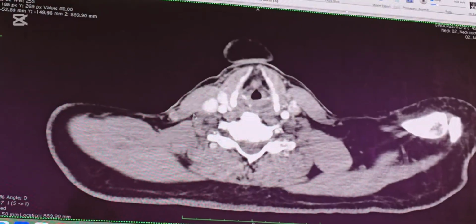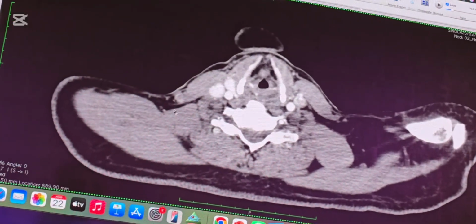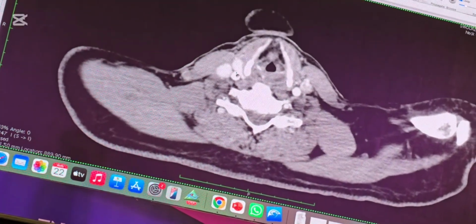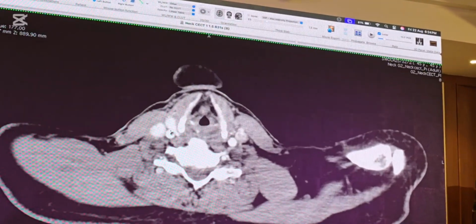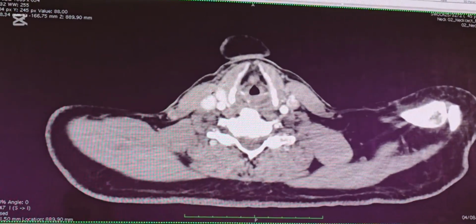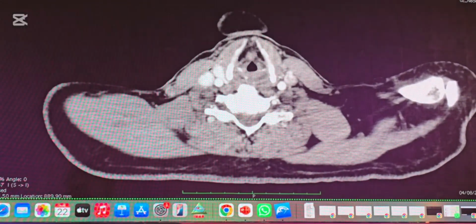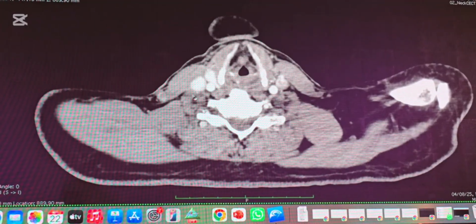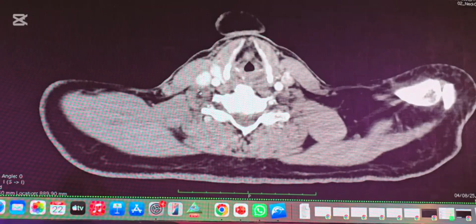So whatever swelling you see, whatever here or posterior triangle issues, this area is basically the lymph nodes distributed along the great vessels, right? So any swelling over here, this area, most commonly it will be lymph nodes or arising from the vagus. See, depending upon the space, I'm not going to talk pathology. So depending upon the space, we have to correlate with the lesion.